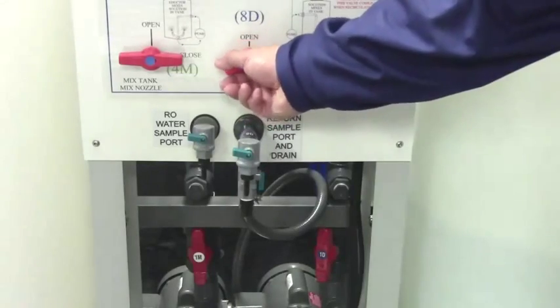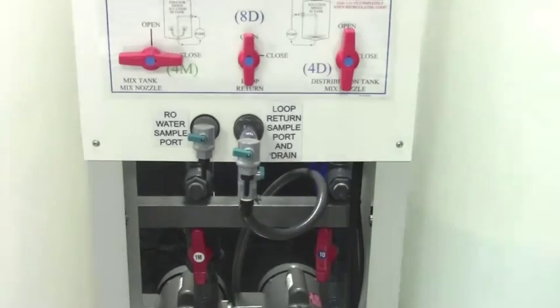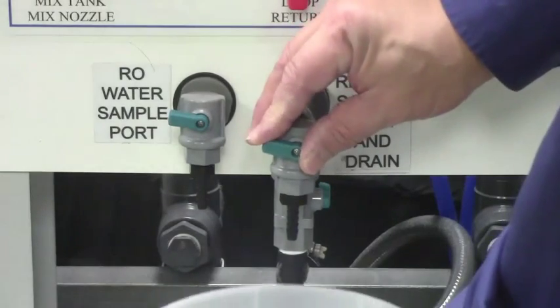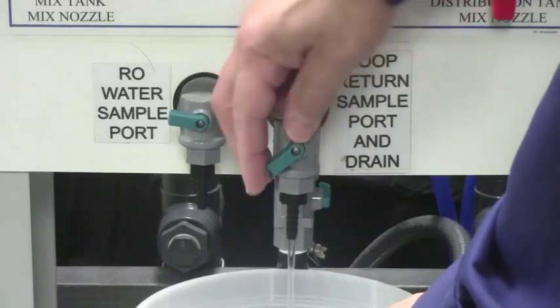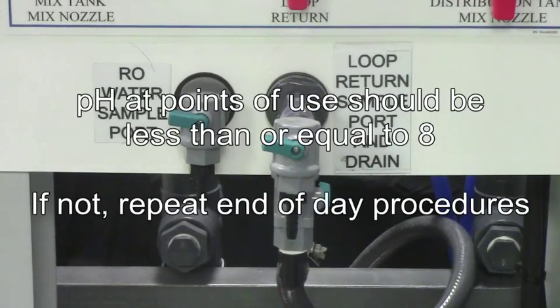Open 8D and close 9D and the water will begin to recirculate through the loop. Open the loop return sample port for at least 5 seconds, then close it. Rinse the points of use until the pH is less than or equal to 8. If the pH continues to be greater than 8, repeat the end-of-day procedures.